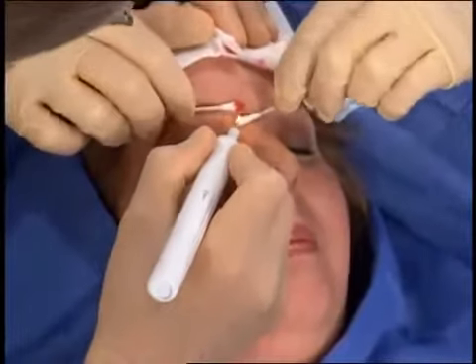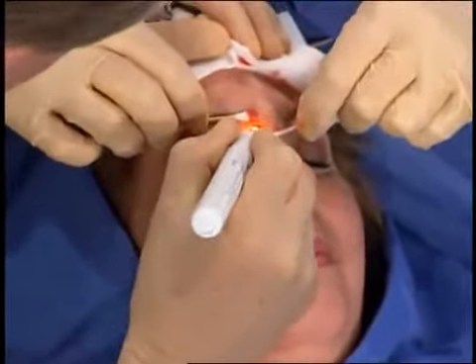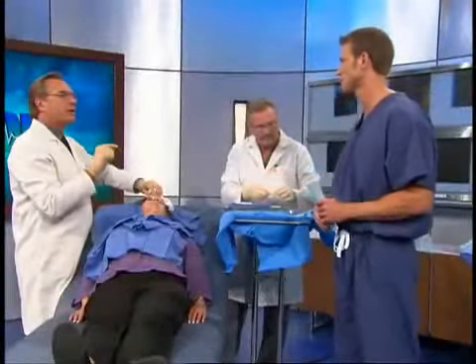One of the reasons that people do get their moles removed is because sometimes moles change. And sometimes you have to be concerned, is this mole cancerous? And if it is, you need to see your doctor and get a biopsy. And that's the reason we remove moles beyond, this is purely for cosmetics. This is what you call an excisional biopsy. We're going to send this. It's going to be analyzed. I mean, I'm 99.9% sure that this is benign. Why? She's had it all her life. It hasn't changed. There are really many reasons to get these moles removed. And one of them can be, hey, I just don't like it.